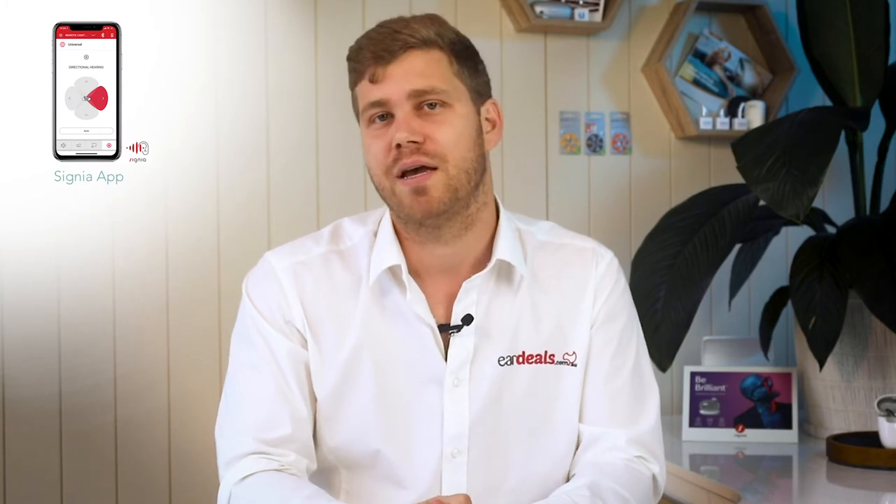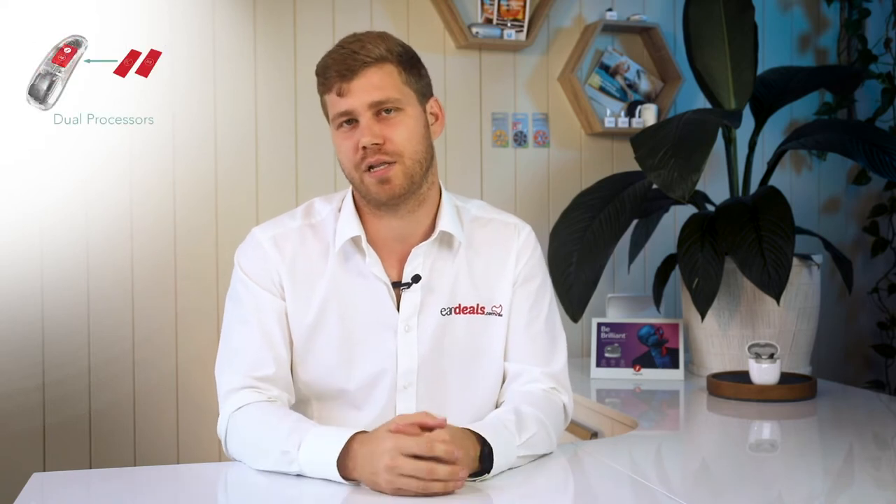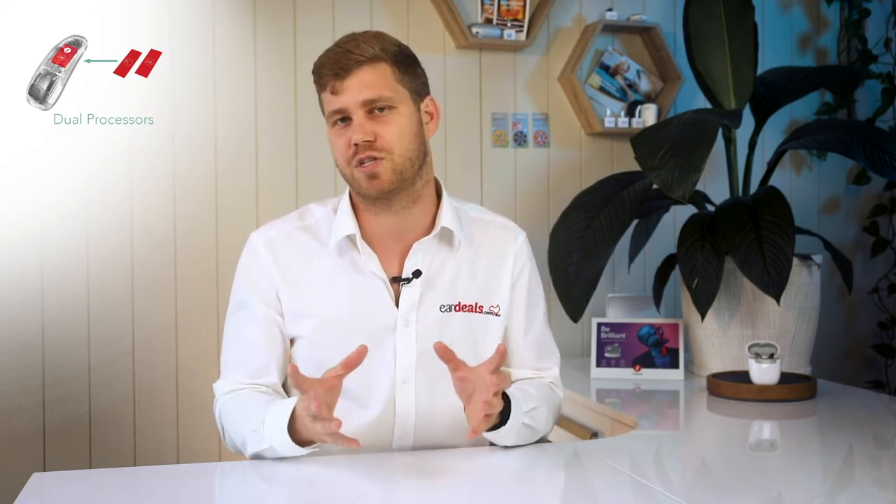You also get Signia's premium AI offering, run through the Signia app, which gives you the ability to make artificial intelligence-driven adjustments to your hearing aids on the go. You can also traditionally adjust things like volume, bass, treble, and balance through the app. Additionally, Signia's groundbreaking Augmented Experience technology uses a dual processor — the first concentrating on important sounds like voice, and the second on environmental sounds — giving you a more comprehensive, natural listening experience.